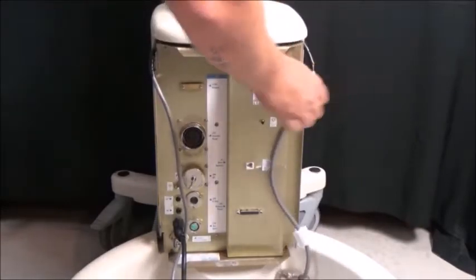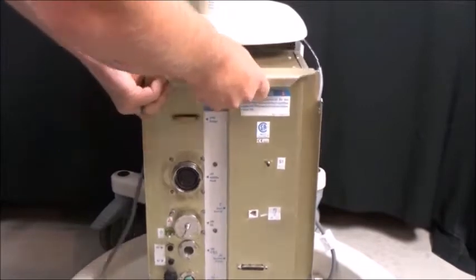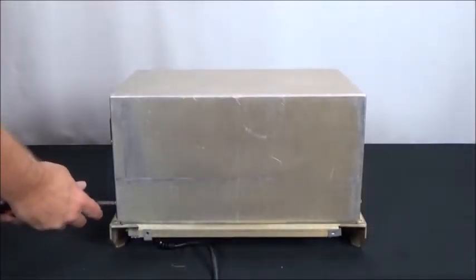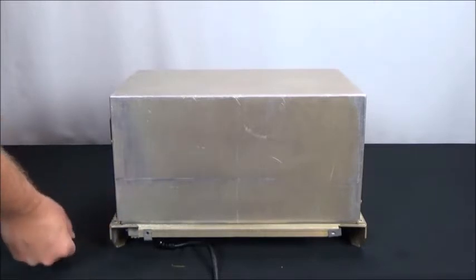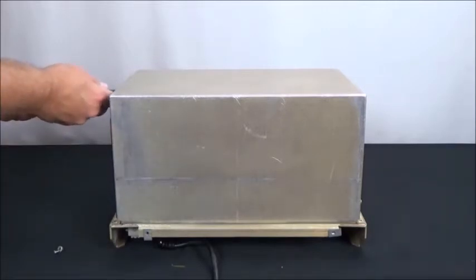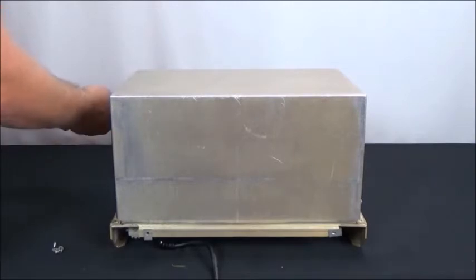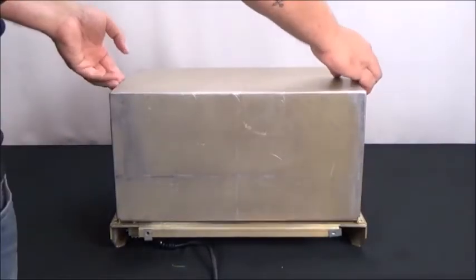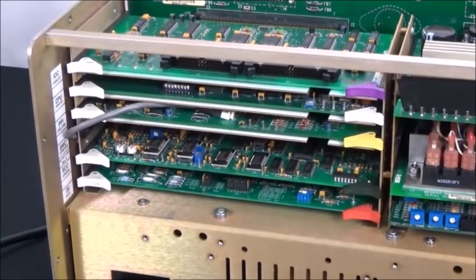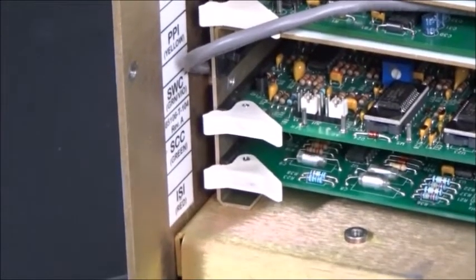Taking care not to damage the two cables at the top of the box, take out the main control unit and place the box on a table. Take the side covers off the control box, 6 screws on each outer end of the box, to reveal the circuit boards. Whether your box is rack mount or all-in-one, each board is labeled and has color-coded tabs.